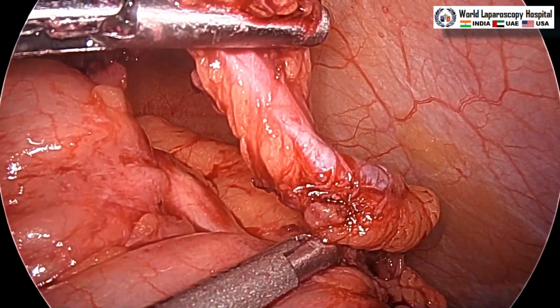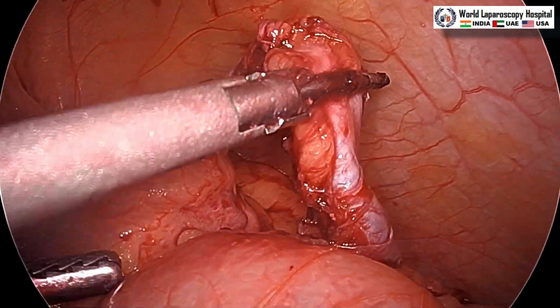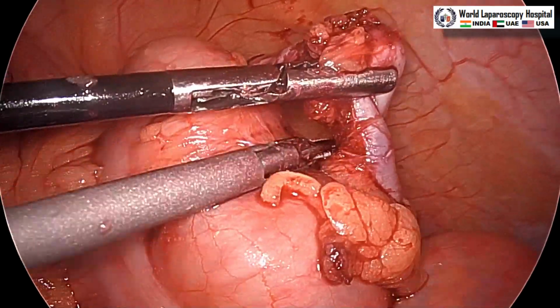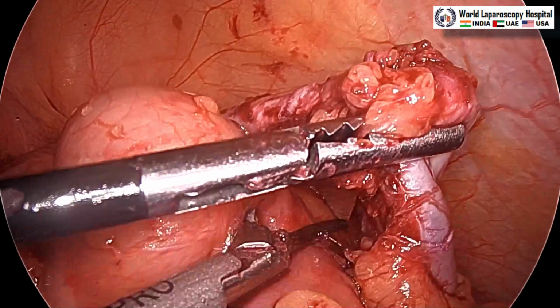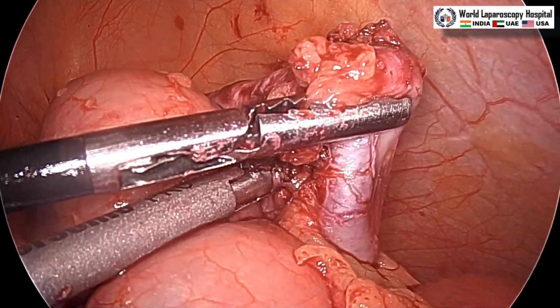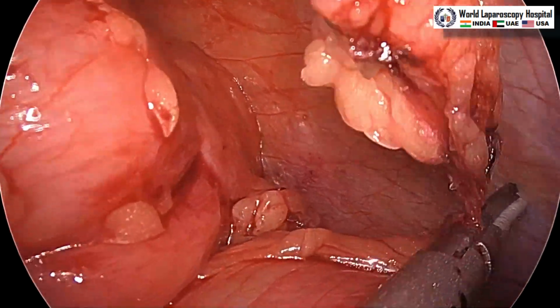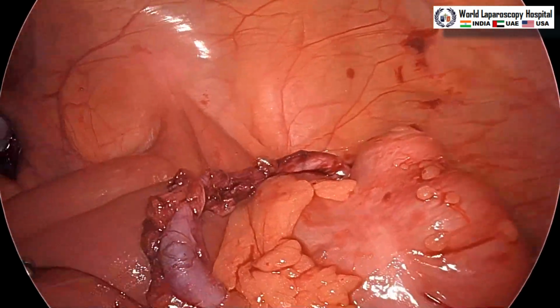So, the patient has a previous history of episodes of appendicitis, that's why we are removing it. And how it looks, it is obvious that it might be creating pain for the patient, because it is not a normal situation of the appendix. Do you know, the harmonic is good in the sense that if we had used the bipolar or hook, it would have been difficult, but the harmonic is making this appendectomy easy in spite of a wrong port position.